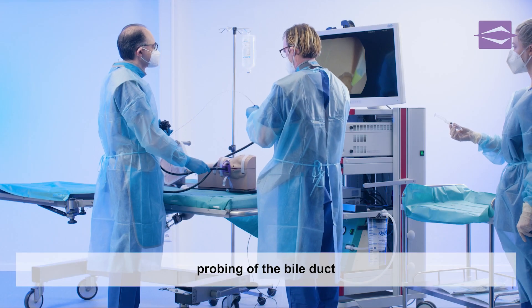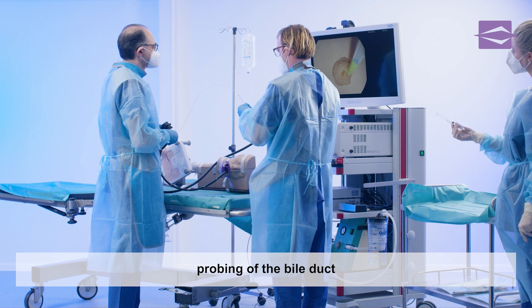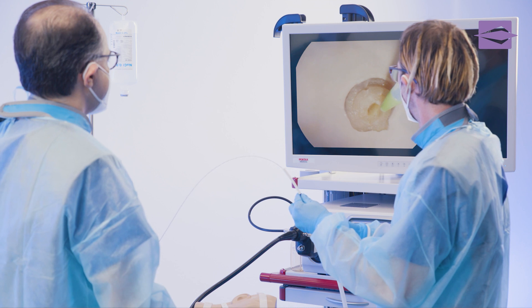The bile duct is then probed by passing the tip of the catheter through the papilla with a slight advance and directing the direction using the Alberon lever on the duodenoscope.